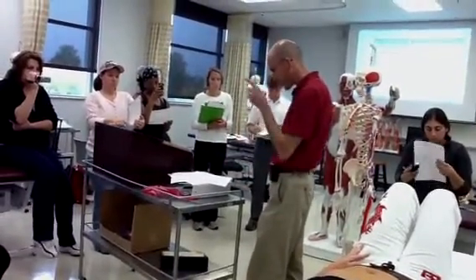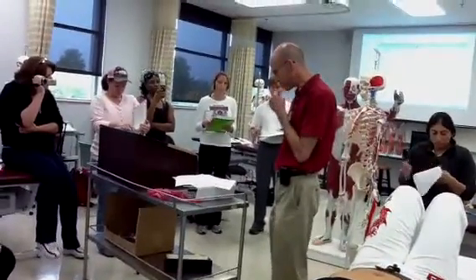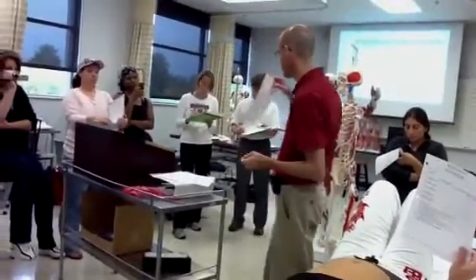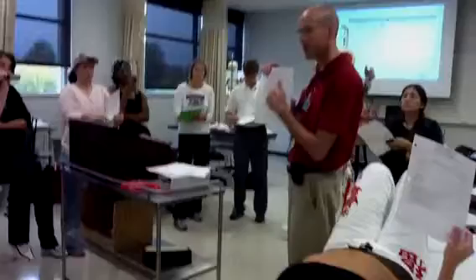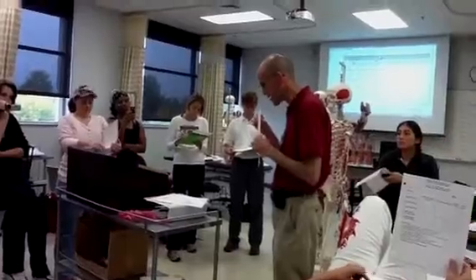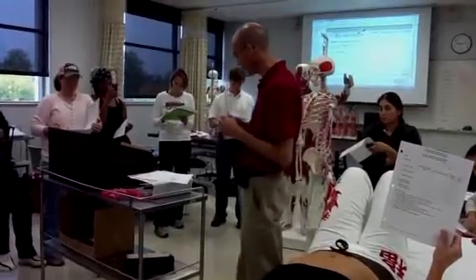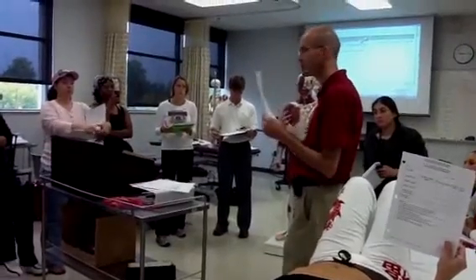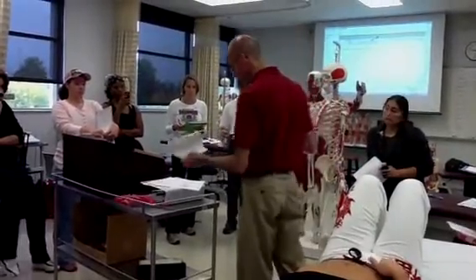And then you're going to, number 9, accurately document your goniometric measurements on a documentation sheet. And I'll show you that in just a minute. What you're going to do is I'm going to give you this piece of paper, or Chase is going to give it to you when you're done. And on the back of it, you're going to do your little quasi-SOAP note. So that's what number 9 is talking about. When we're done, I'll show you what I'm looking for with documentation. But on this sheet, I'm just saying what your goniometric measurements were. And then you'll do the quasi-SOAP note on the back after you finish the skills test.